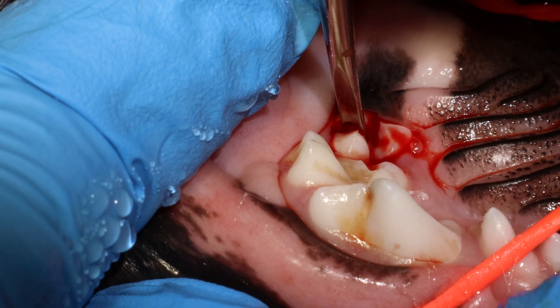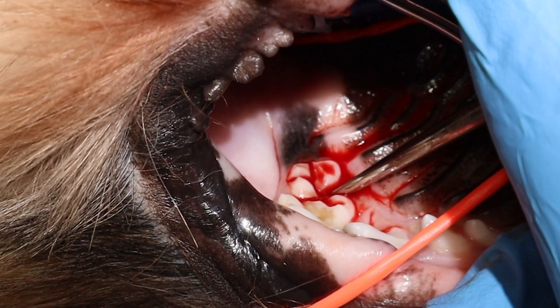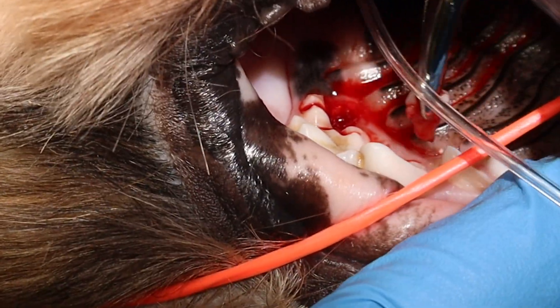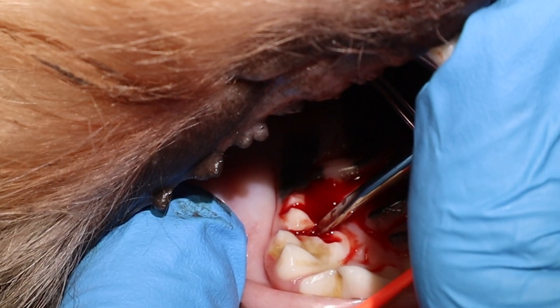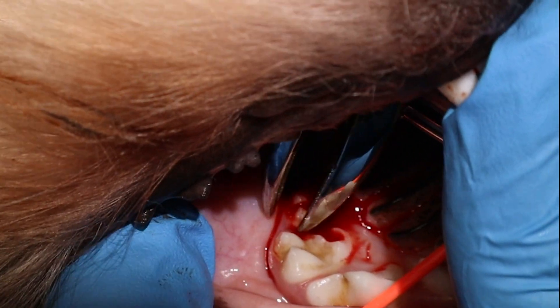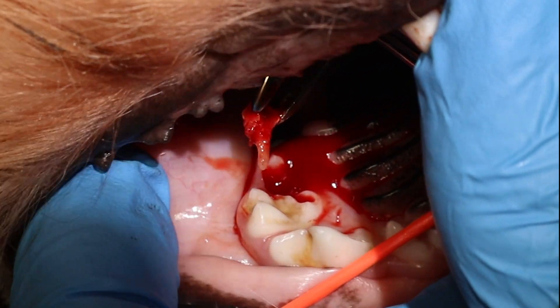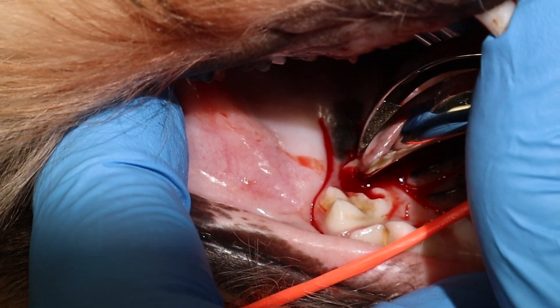I'm just putting some pressure on the roots and taking them out one by one. I always start with getting out the palatal root. The mesio-palatal spot is great for placing your luxator, and you can put a good amount of force on this root — it will most likely not break. First root is out. These buccal roots have to be extremely loose before you attempt to pull them out, because they're very easy to fracture. I have a long curved forceps with diamond coating on the end so it does not slip, and I just gently rotate and pull. Pull and rotate is allowed — you're not allowed to bend.